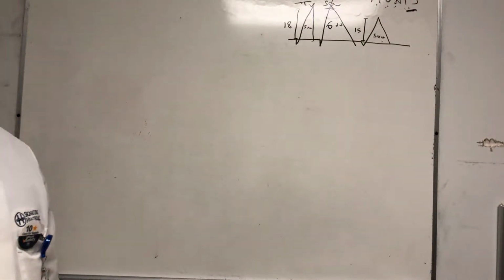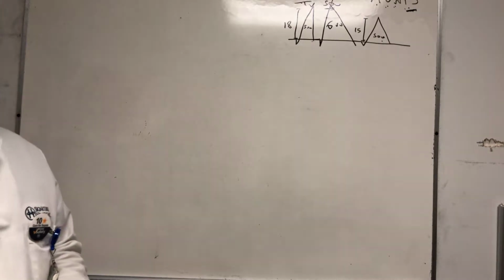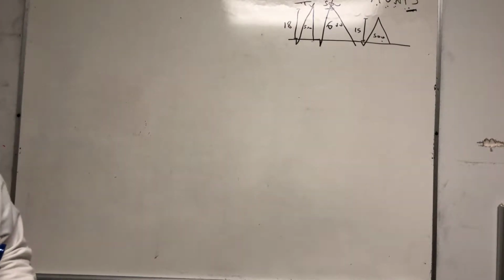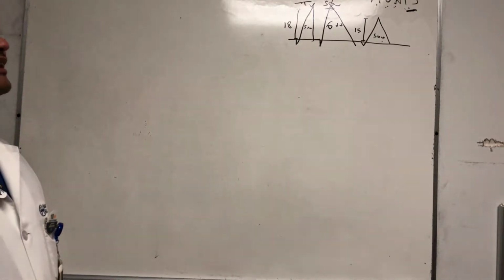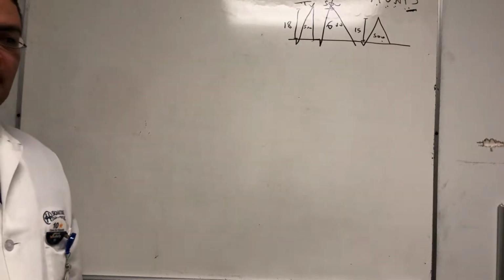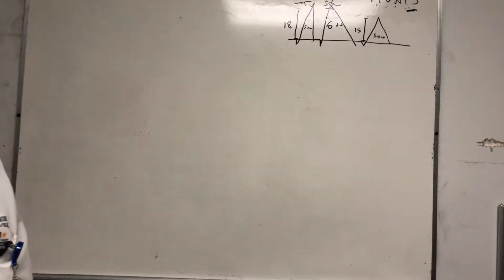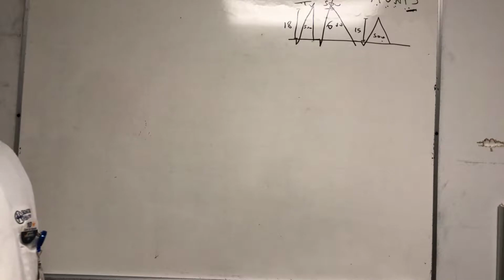You don't need an intensivist. Next generation, if we have an arm that goes in and extubates the patient, then you don't need anything. You just send the patient with a tube home. So that's the AVAPS. We have this available in the BiPAP machine. It can be used as a BiPAP mode and also a vent mode.